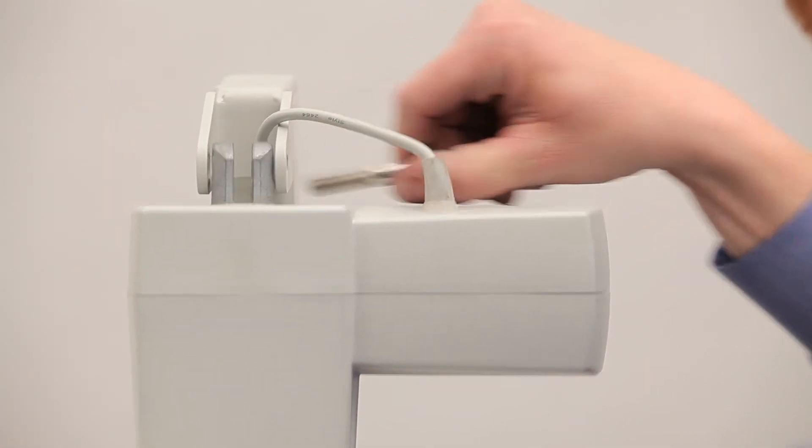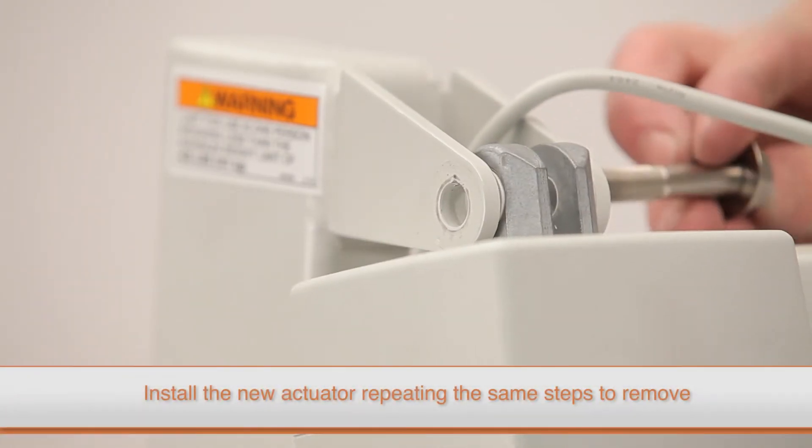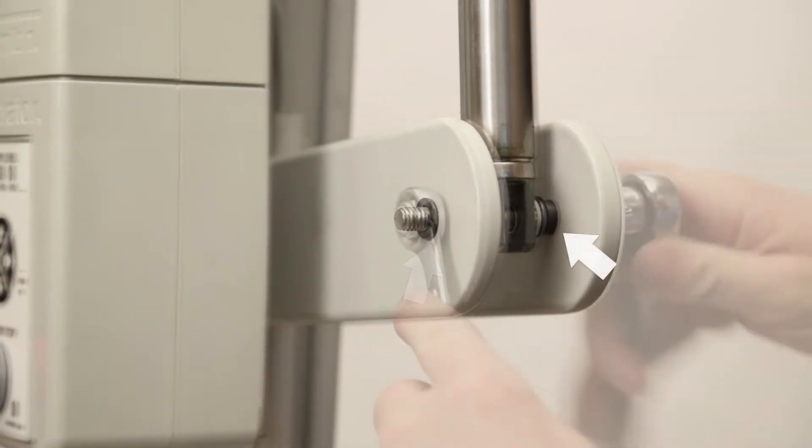Carefully remove the actuator. Install the new actuator, repeating the same steps used to remove the old one. Make sure the bushings on the inside and the outside of the support arm are installed correctly during reassembly.